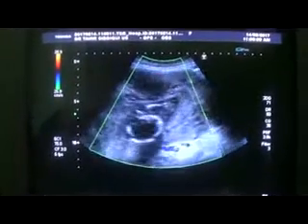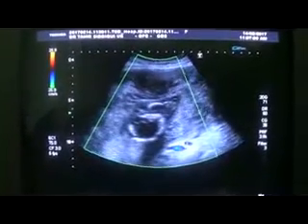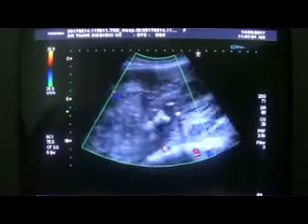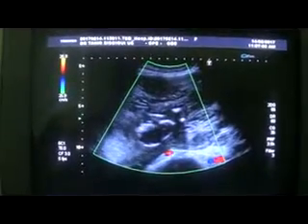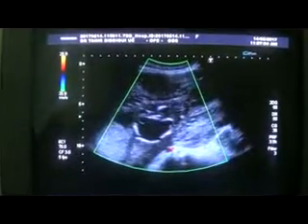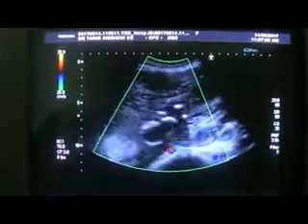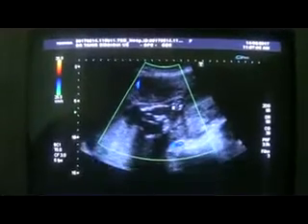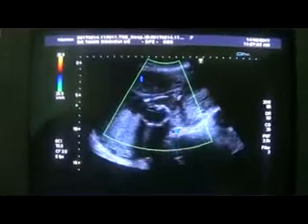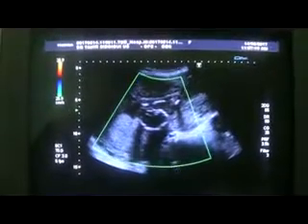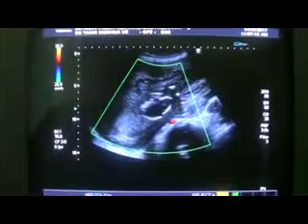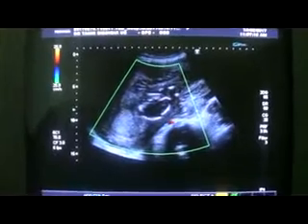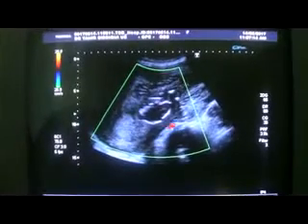And here in the pelvic region, you see a fetus and placenta as well.